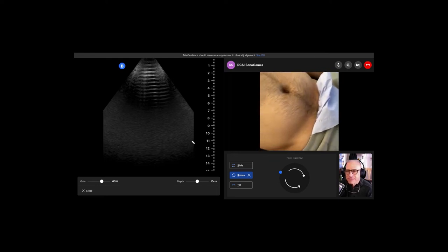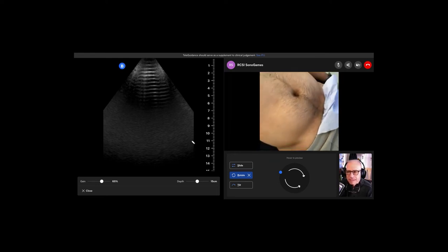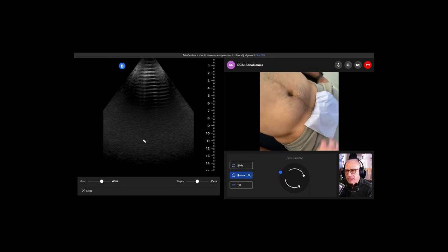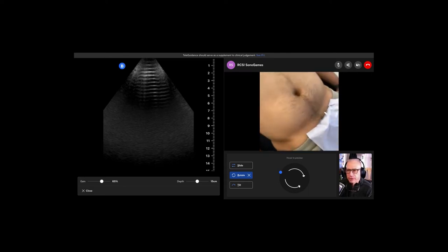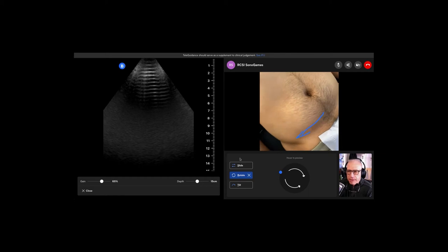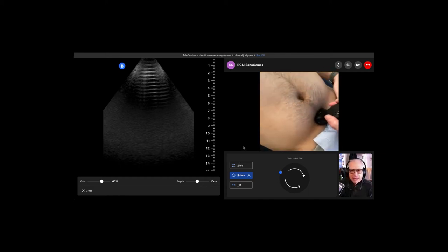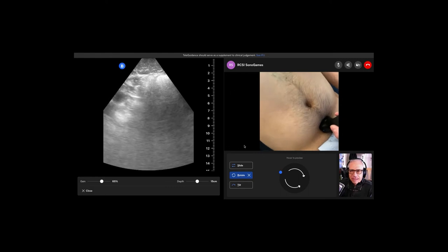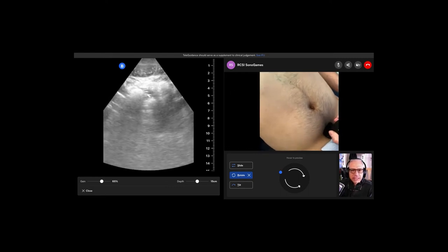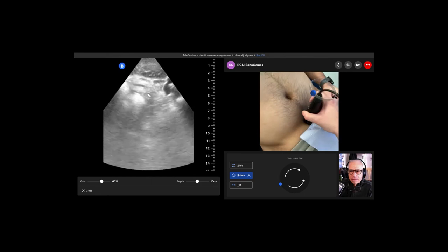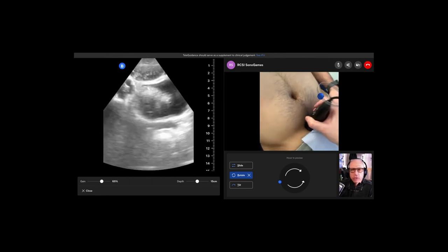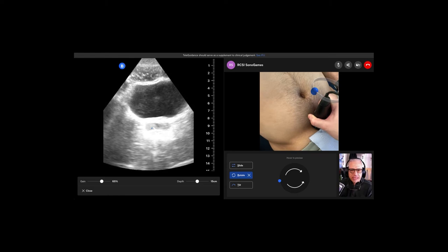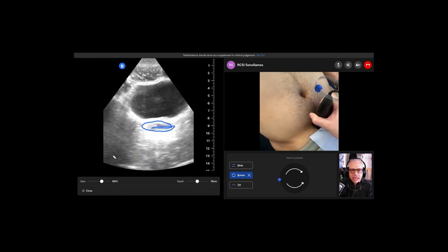So you can either do, what is it? Longitudinal or transverse? Yeah. That's correct. And I think the standard is most people will go start with a transverse, again, dot towards the patient's right. So where is the bladder? Yeah, there you go. Right. So this is something that's really important, especially for a man. You see this thing here? Is that fluid? Is that free fluid?